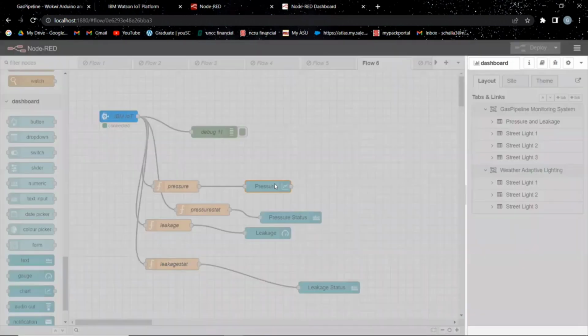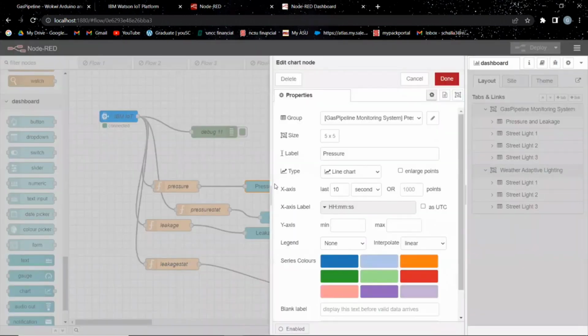So double click on the chart to configure it. So group it accordingly under the particular tab. And then we have to label it as pressure since it shows the pressure statistics. And then for the type, we are selecting the line chart. You can select any of the charts according to your preferences. And then provide the appropriate labels and ranges. Select the series colors and click on done.